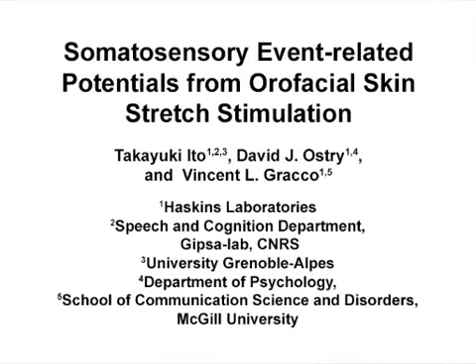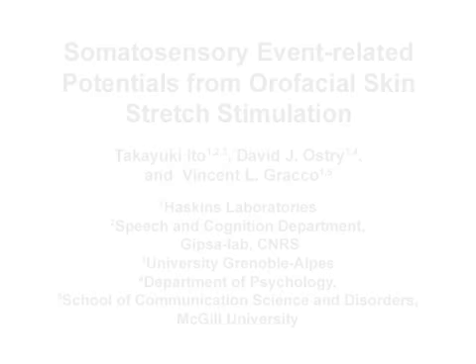The overall goal of this somatosensory event-related potential recording using orofacial skin stretch stimulation is to investigate cortical processing associated with orofacial somatosensory inputs in speech production and perception. This is done by selectively and precisely deforming facial skin in a wide range of speech behaviors.